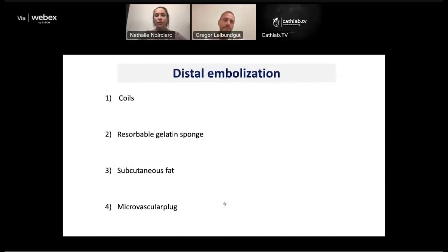And do you have this for any territory? Yes. And then, of course, it looks localized. You can say, okay, it stays, but whatever can happen, especially when patients are hypertensive, is that secondarily this hematoma ruptures and opens to the pericardium. And I think this was what happened in your case, and then you have a tamponade. So it could be a 2-time event. Okay, yes.